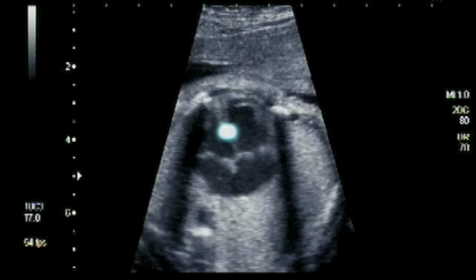And of course, this is just because the scan beams have got nothing to bounce off. So for example, when you get a really good view of the aortic outflow, that will also be a view where you get a really good view of the right branch of the pulmonary. But a good view of the ductus arteriosus will probably mean you've got a lousy view of the aortic outflow and right branch. So know and love artifact and use it to your advantage.